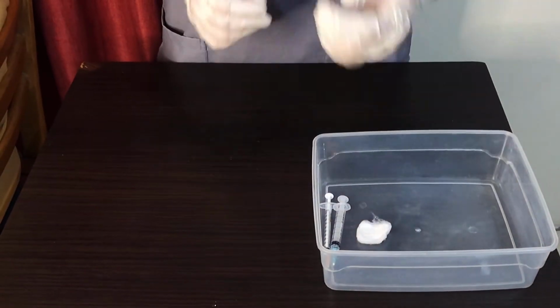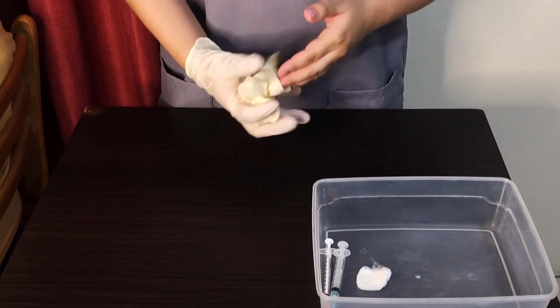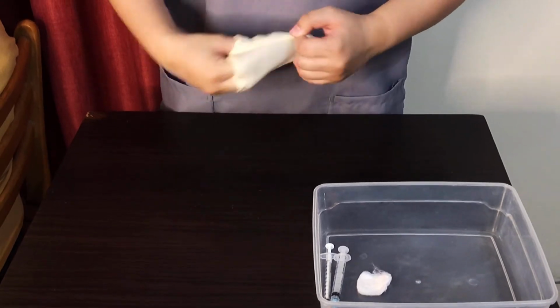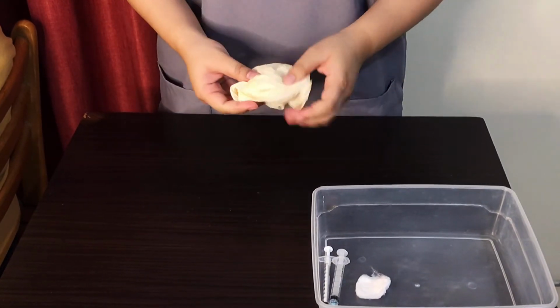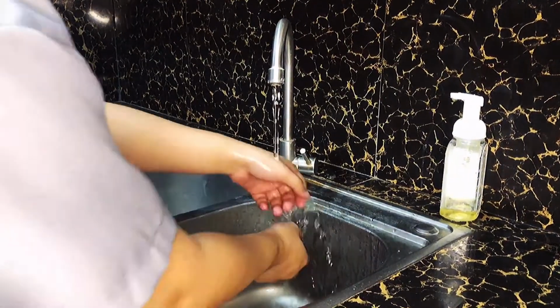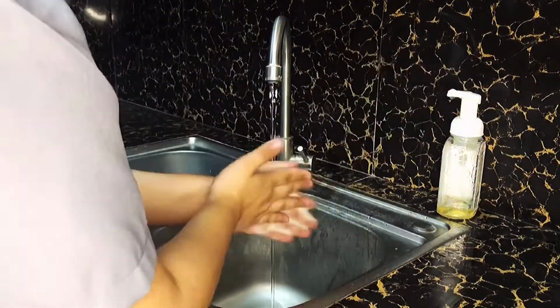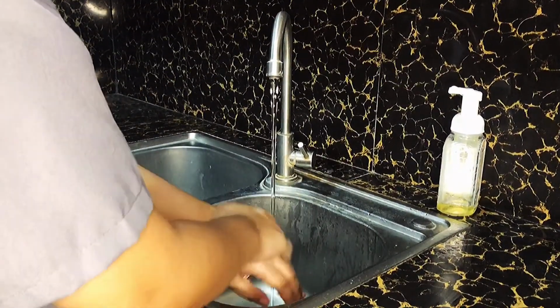And yes, don't forget to dispose of your supplies. And also, remove your gloves. After doing the procedure, don't forget to perform hand hygiene, okay?